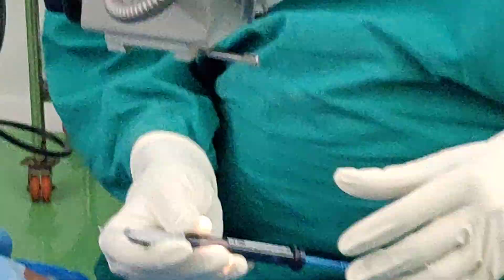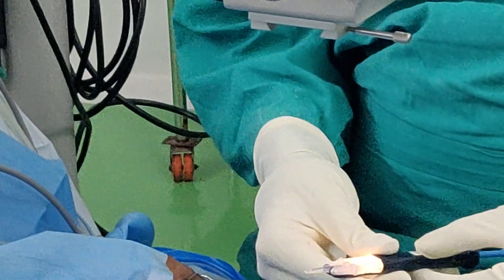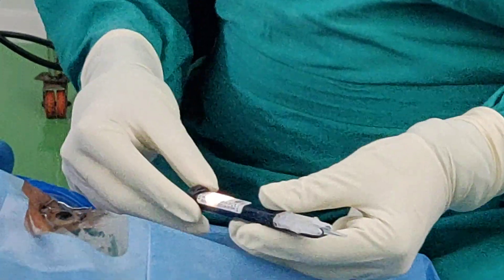This is the hydration port — you can see it here. Inject the viscoelastic and fill the hydration port. You can see the filling of the hydration port; the viscoelastic or VSS is filled into this hydration port. Once you fill the VSS or viscoelastic in the hydration port, you then inspect the device.